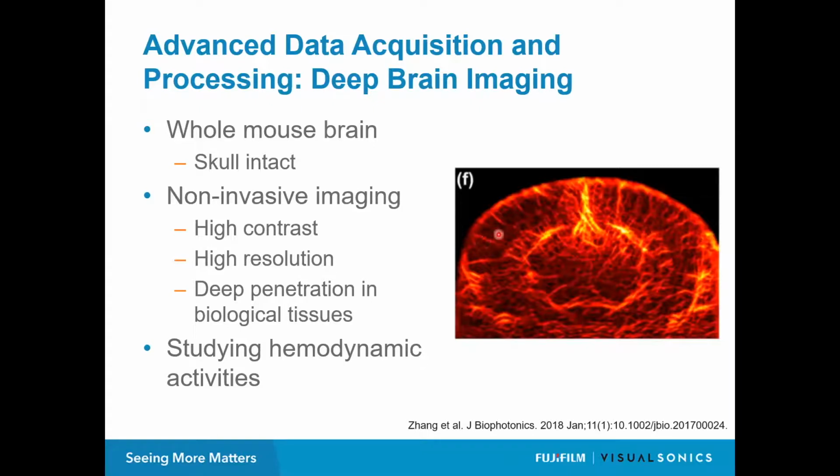And just by using the optical properties of the blood, creating this blood map or perfusion map on the mouse brain, allowing them to do several studies. In that specific case, they looked into epilepsy, but they can also look into strokes, stroke models, for example, anything that affects the vasculature, or stimulate the brain to see how the vasculature changes. Completely non-invasive.